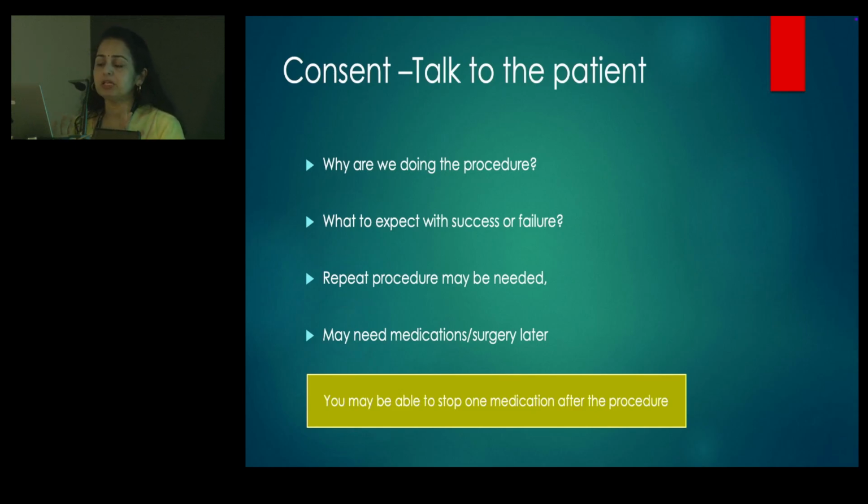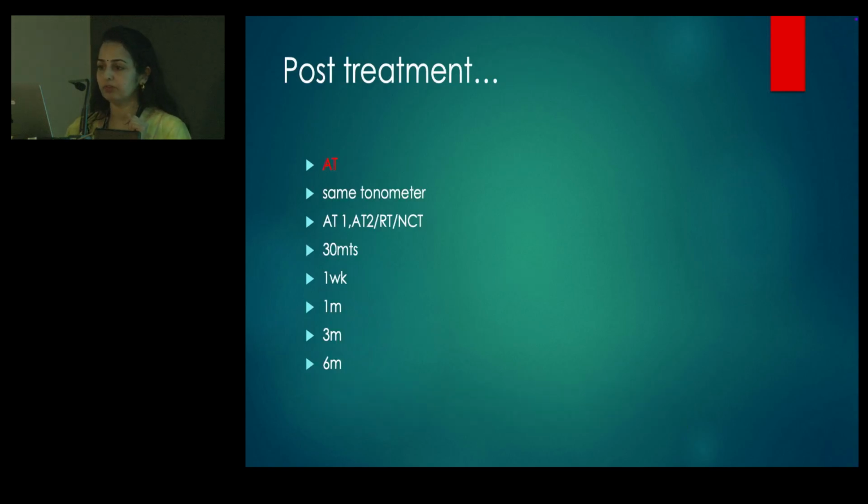A practical way of dealing with it is tell the patient that you may be able to stop one medicine. Then the patient will be expecting that only. You may be able to stop one medicine after this procedure.